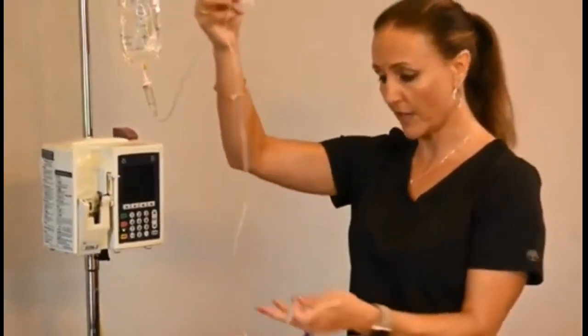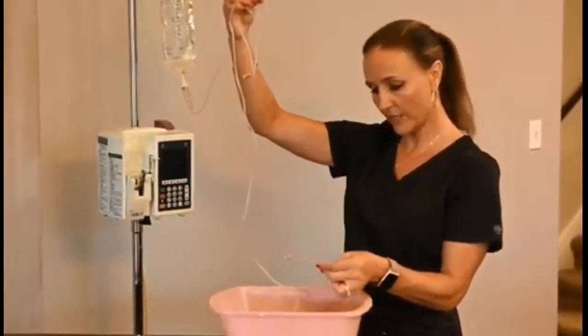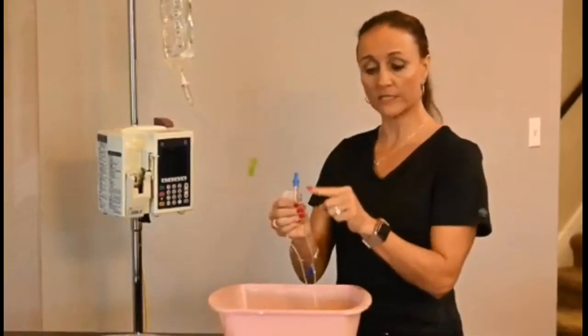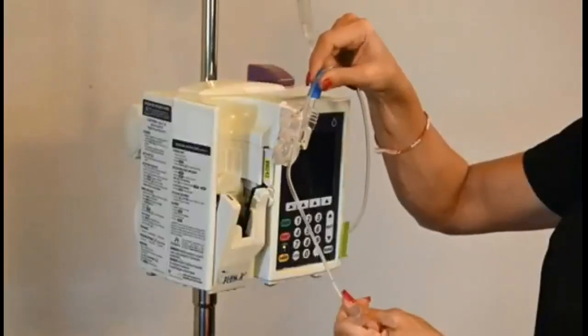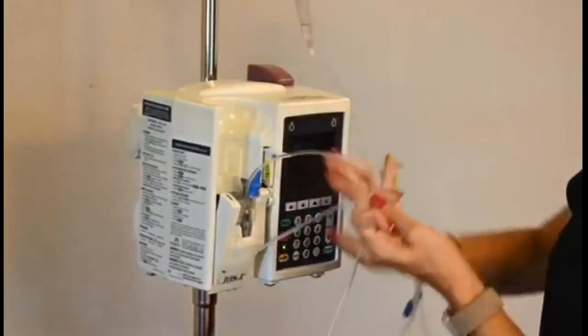Once it's plugged, I follow this all the way, and I make sure I have no bubbles, and then it starts to drip out. Then I'm going to go ahead and clamp and put my lid back on because I need to keep this sterile. Then what I can do is I'm going to come to my pump, and then I will just insert the cartridge into the pump.